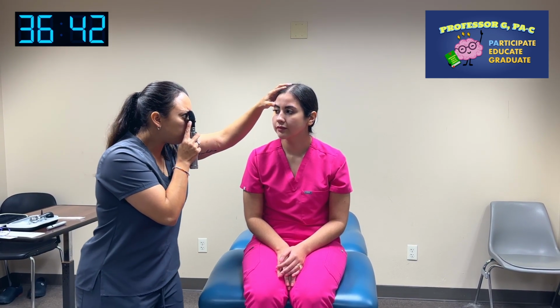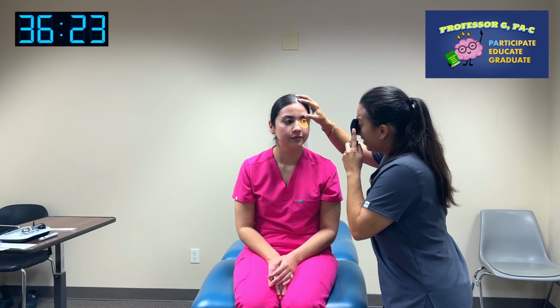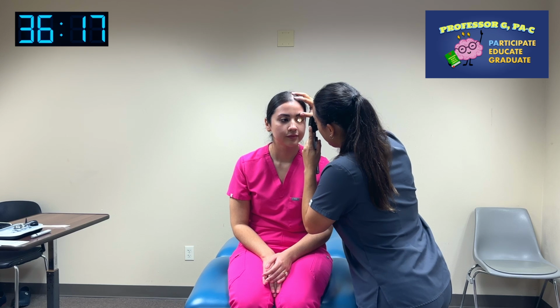All right, last but not least, we're going to take a look at the back structures of your eyes, like inside your eye, okay? And it is going to be a little bit bright, so just bear with me. I'm going to ask you to just kind of pick a spot on the wall over my shoulder and stare at that, okay? All right, you found the red reflex. All right, look at my light. Very good. All right, let's take a look at the other one. Okay, very good. Got the red reflex, looking at the optic disc, the vessels, and then look straight at my light, and the macula. Quick look. All right, that concludes the eye exam.